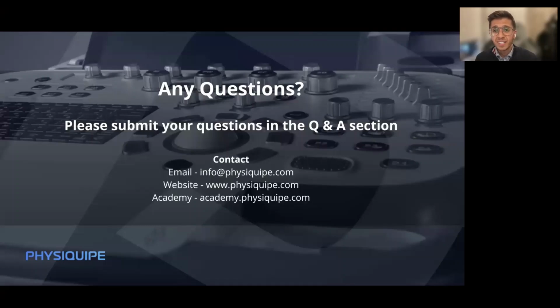There are lots of introduction courses as well, if you're just getting started. There are 1 or 2 day courses that can be really helpful just to understand how you actually turn on the machine and change the settings, things like frequency, depth, and gain, which can be a bit fiddly depending on the machine you use. So learning those basic principles in those intro courses can be really helpful, and also how you hold the ultrasound probe, because at first, you think I'll just pop a probe on, but it actually can be really fine movements. It can be really delicate to learn that. So that's kind of where I start.